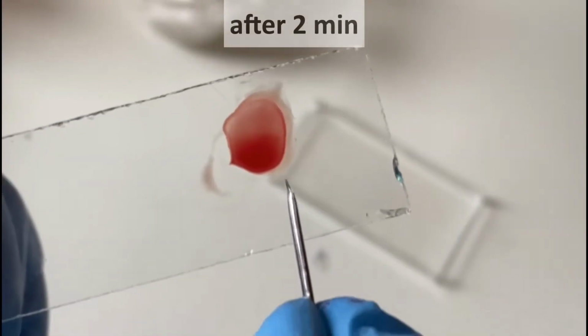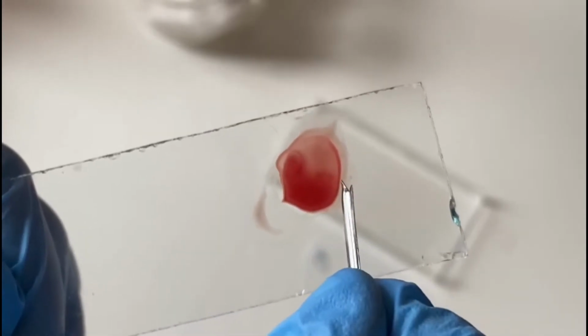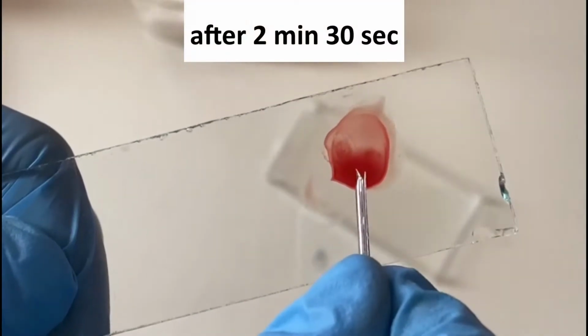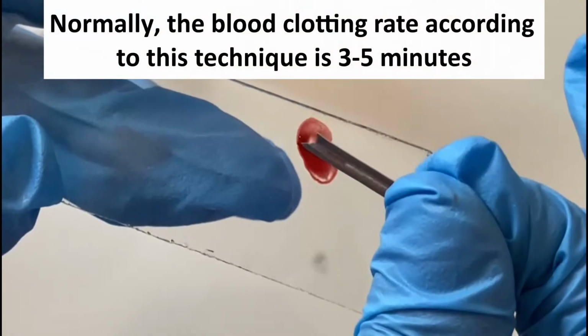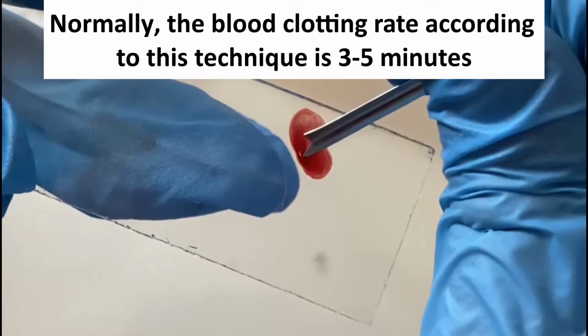After 2 minutes, every 20 to 30 seconds, it's necessary to pull up the drop with a needle, tracing the time of the appearance of fibrin. After the detection of fibrin filaments, they fix the time of the end of blood coagulation.